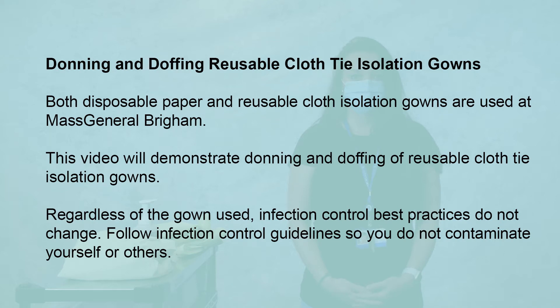Donning and Doffing Reusable Cloth Isolation Gowns. Both disposable paper and reusable cloth isolation gowns are used at Mass General Brigham. This video will demonstrate donning and doffing of reusable cloth isolation gowns.